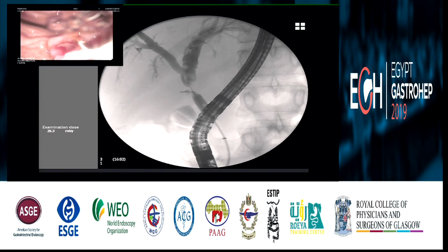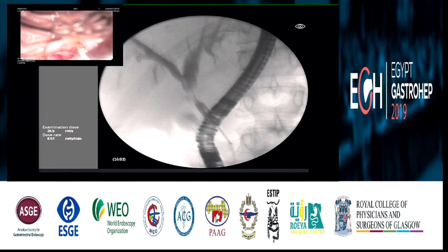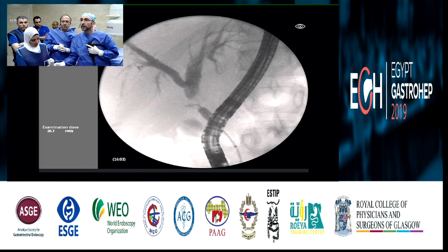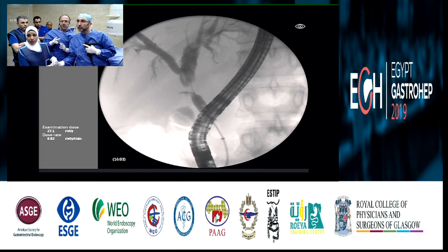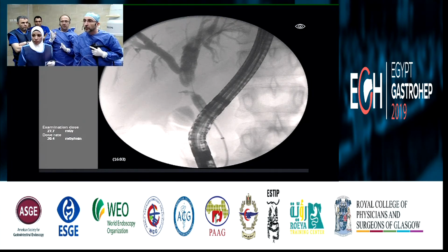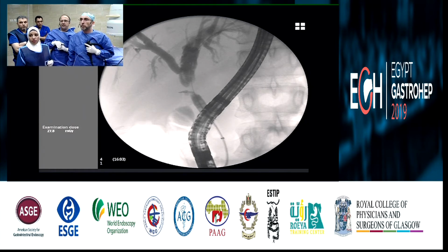I think the distance between the lower end of the confluence and the upper margin of the stricture might be a little too short, so the stent will stay in a triangle configuration towards the tip that might favor migration. So I would be happier if I place first a plastic stent on one side, and then we can make the metal go to the left. I will place an 8.5 towards the right, across the confluence, and then go with the metal towards the left.